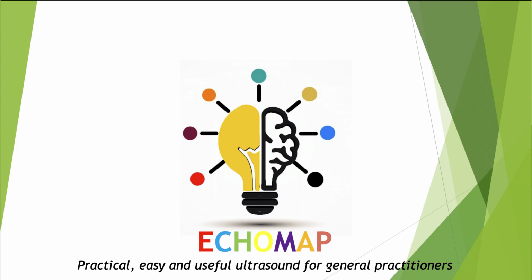So today, we're not talking about a clinical case per se, but rather a brief review of prostatic echoanatomy.